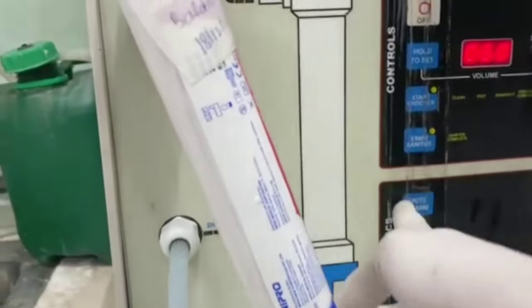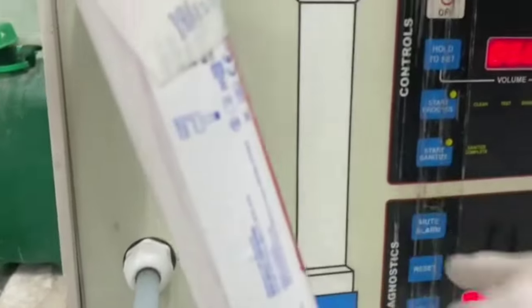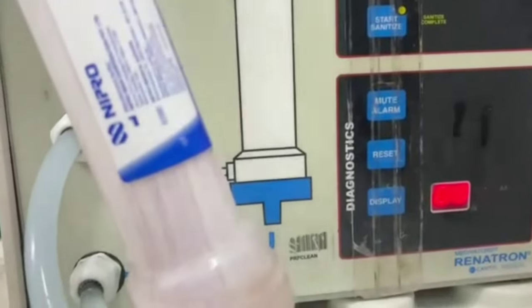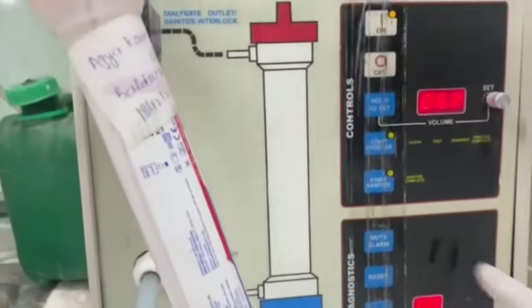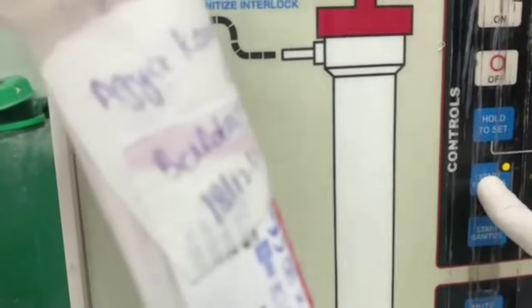Long press — make sure you long press the button. Then click start process, click start.